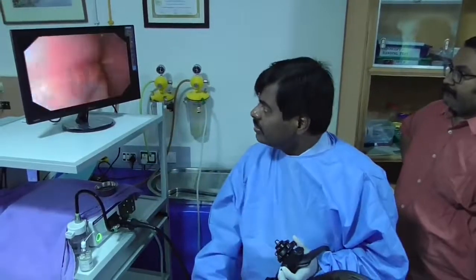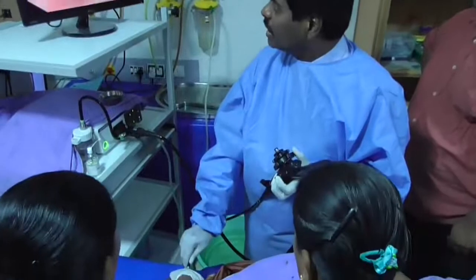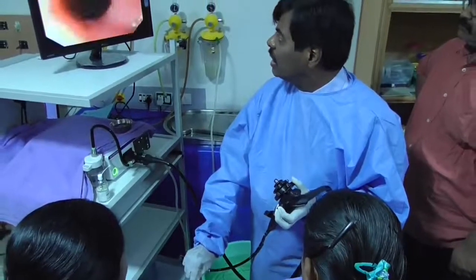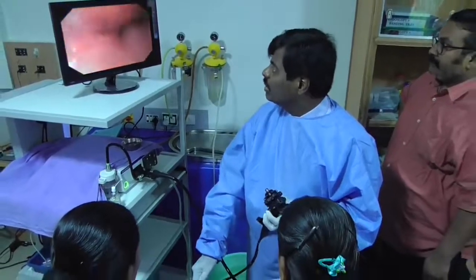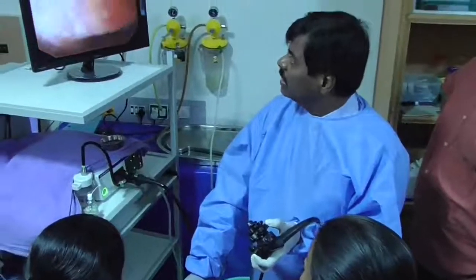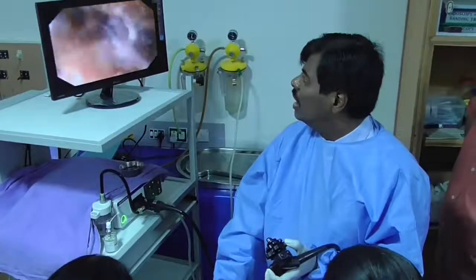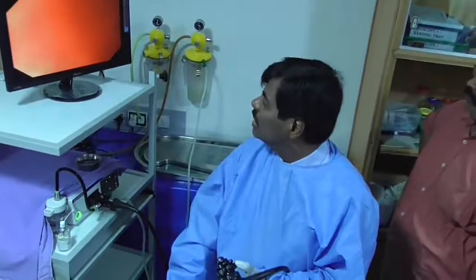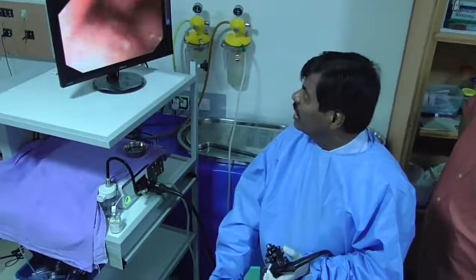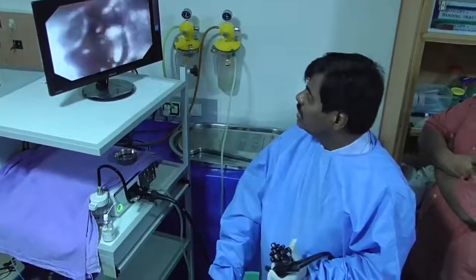Withdrawing the scope, we pass the Z-line. Keep my right hand very close to the patient's mouth for better control — if you hold it far away you lose control. Walk the scope back two or three centimeters at a time, sucking as required so the patient is comfortable. Around 15 centimeters, do a little flick of the big wheel towards you and you will be able to witness the vocal cords — a glimpse of the vocal cords if you are lucky. The patient is not always tolerating at this point. We are coming back and you will appreciate the uvula.